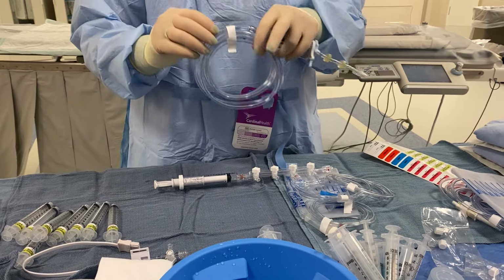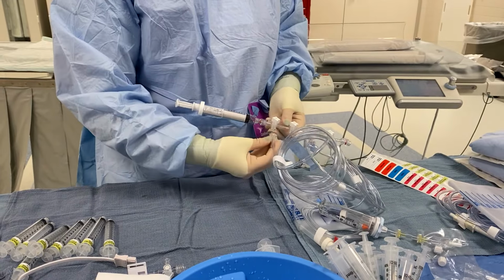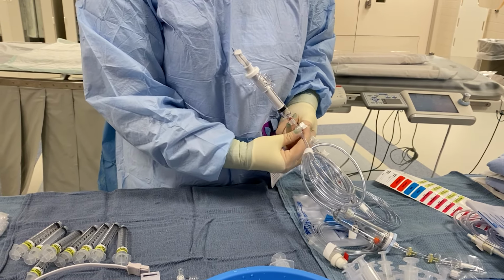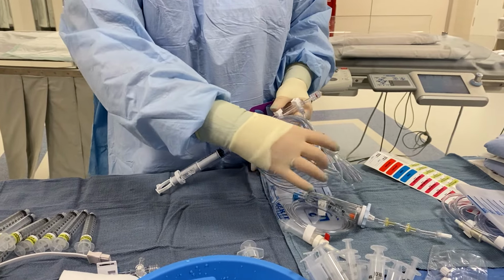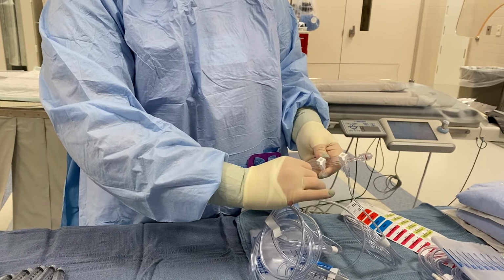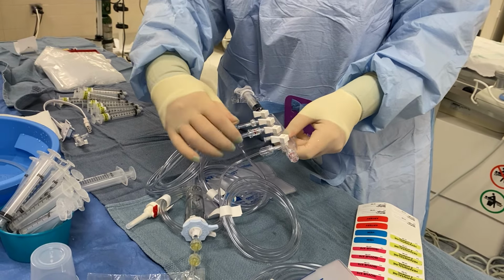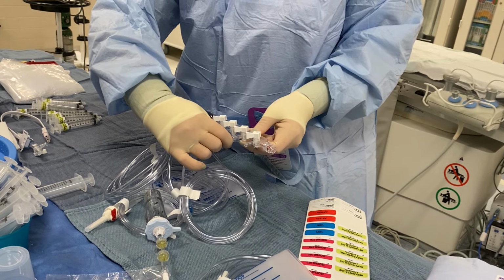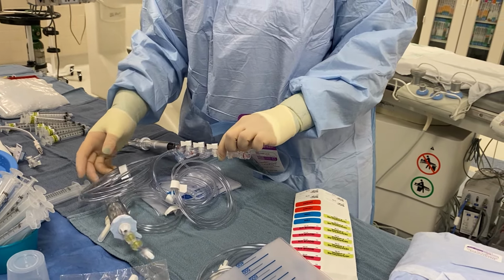And then I'm gonna find my line for contrast, and that's just gonna connect right on the top port up here. Now because we only have 3 lines but 4 ports, there is gonna be one open port. So for our example today, we're just gonna move everything up 1 port. So I'm just disconnecting and twisting on. And then moving this one up as well. So our open port will be the one on the distal side.